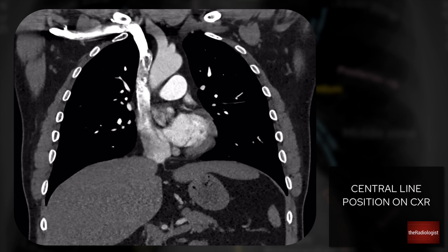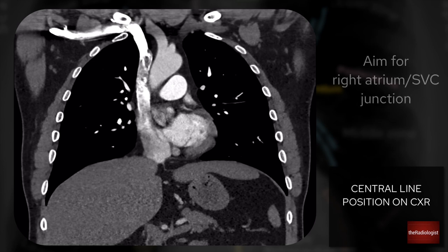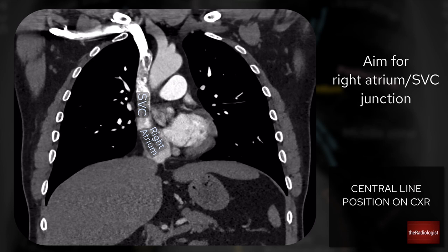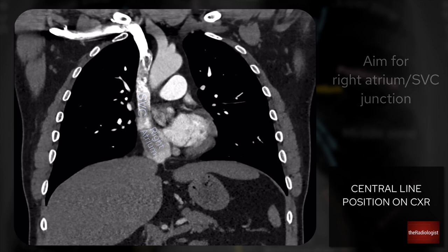Where should the ideal tip position be? It's a little bit controversial. Traditionally we look for a tip being between the SVC and the right atrium. It's been thought that if the tip is too low and goes into the right atrium, that can be a risk factor for cardiac perforation or arrhythmia. However, the evidence doesn't really back that up — for dialysis catheters we actually place them within the right atrium on purpose and that doesn't cause too many issues. There is a school of thought that if the tip is within one of the venous structures on the right side of the mediastinum, that's probably okay depending on what the line's used for and if it's only for a short period of time.